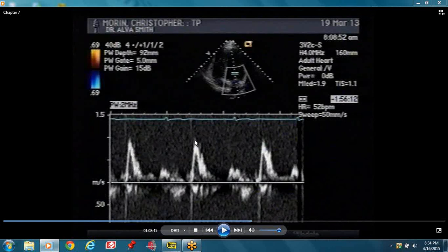You get your E-velocity — there looks like a diastasis. Then you have your A-velocity because of atrial contraction forcing blood into the ventricle. Then you'd have your IVCT before you have ejection.